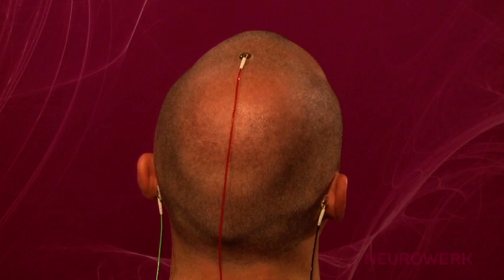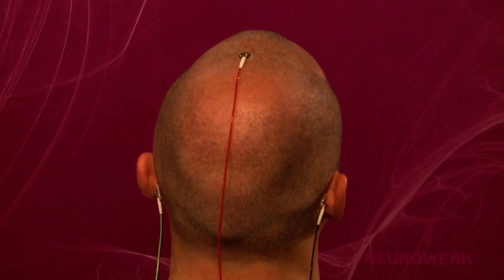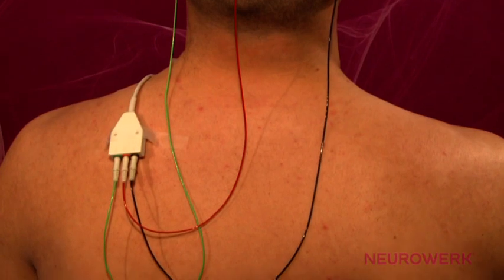Before electrodes are adhered, it is advisable to prepare the skin with an abrasive paste to ensure a low contact resistance. The recording electrodes are connected to the corresponding jacks of the common cable.